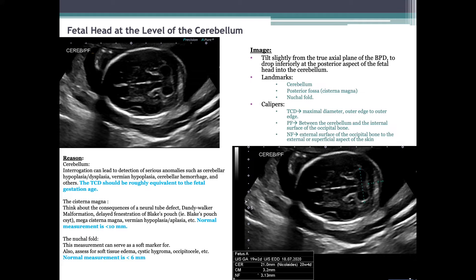To achieve the cerebellum/posterior fossa/nuchal fold view, tilt slightly from the true axial plane of the BPD to drop inferiorly at the posterior aspect of the fetal head into the cerebellum. The transverse cerebellar diameter calipers are placed to demonstrate the maximal diameter of the hemispheres — in millimeters this is roughly equivalent to gestational age, measured outer-to-outer. The posterior fossa measurement places calipers between the cerebellum and the internal surface of the occipital bone. The nuchal fold thickness is documented from the external surface of the occipital bone to the external aspect of the skin. Proper interrogation of the cerebellum can detect cerebellar hypoplasia, dysplasia, vermian hypoplasia, and cerebellar hemorrhage. The transcerebellar diameter should be roughly equivalent to gestational age.